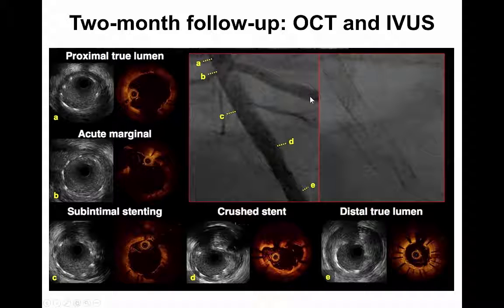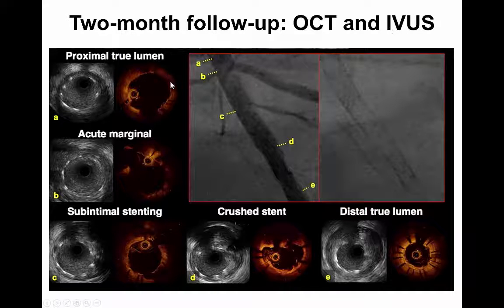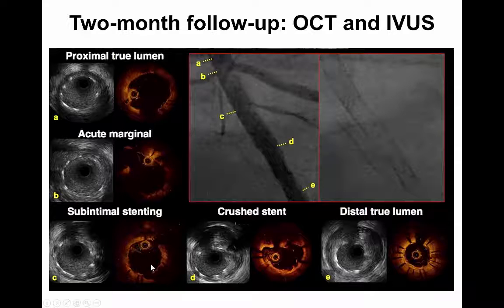This is the side-by-side comparison between OCT and IVUS showing the optimal result at two months with subintimal stenting, the crashed stent, and the stent in the distal true lumen.